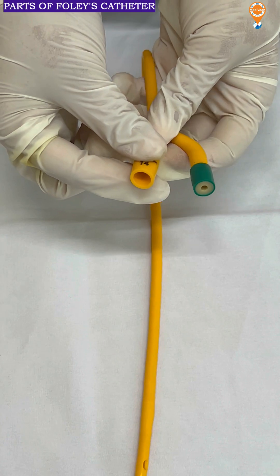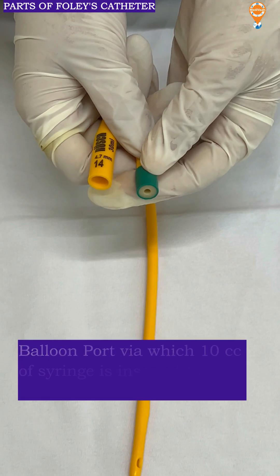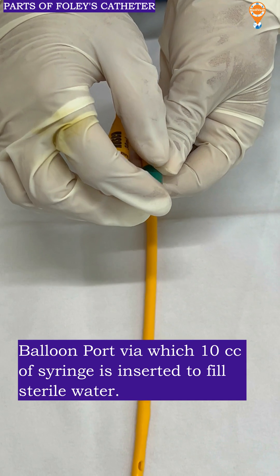This is called the connector port through which the urine bag is being connected and the urine drains there. This is the balloon port through which 10 cc of sterile water is being pushed in and the water stays inside.